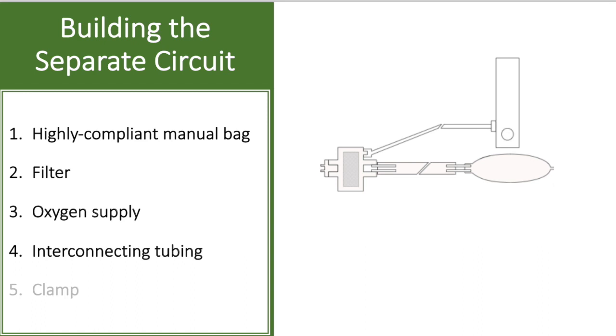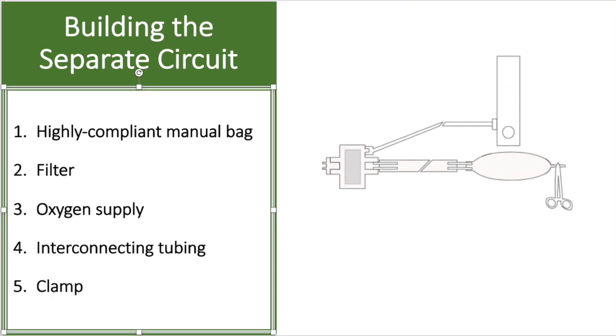and we have connecting tubing to connect between the bag and the anesthesia filter and endotracheal tube, between the bag and the filter. Finally, we have a clamp which we place over a hole we've cut into the bag. This allows us to intermittently completely close or open our circuit.